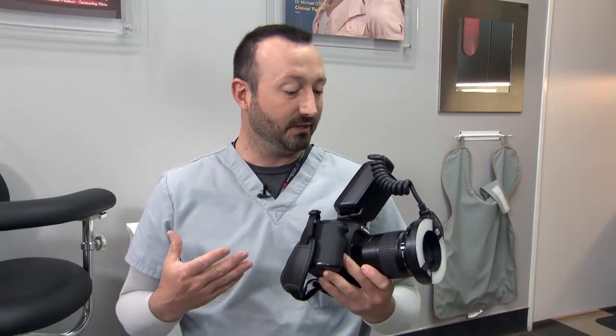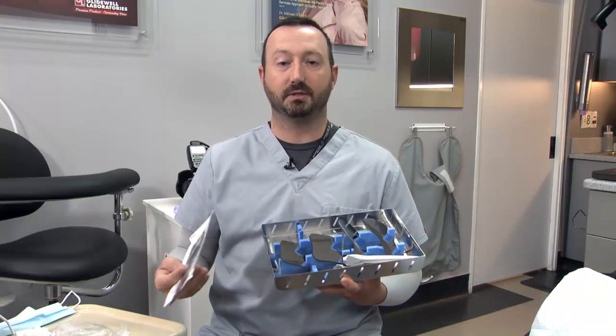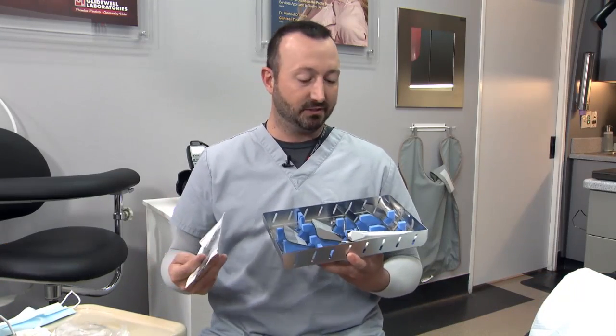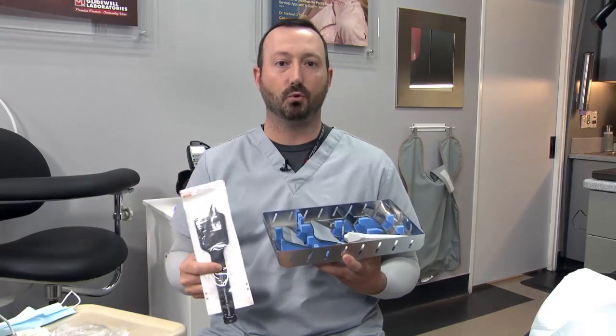What I'll talk about today is how important digital photography is to a practice, but also how important it is to our laboratory and how to get the information we need from the chair to the laboratory and back the way we and our patients want it. The very first and most important thing we're going to need for professional digital photography in the dental office is a professional camera. A nice Canon camera with a ring flash is probably the best choice. It is equally important to have a nice set of mirrors for reflected shots, stored so they won't get scratched, and also some blackout shims so we can cut out any tissue or background distractions.